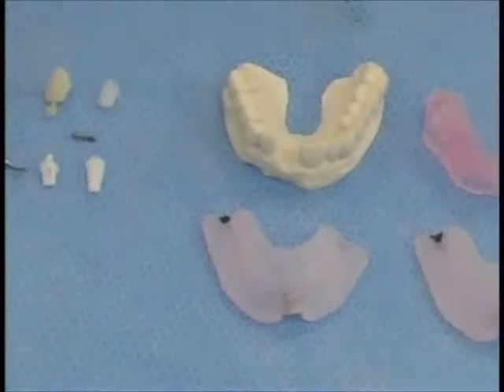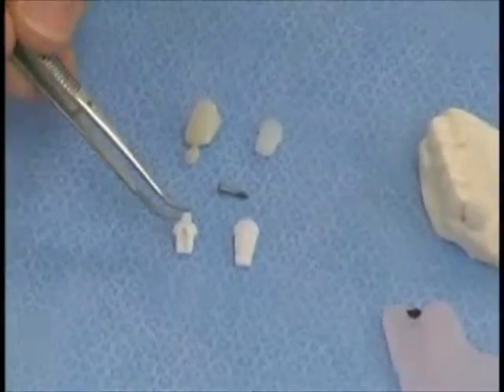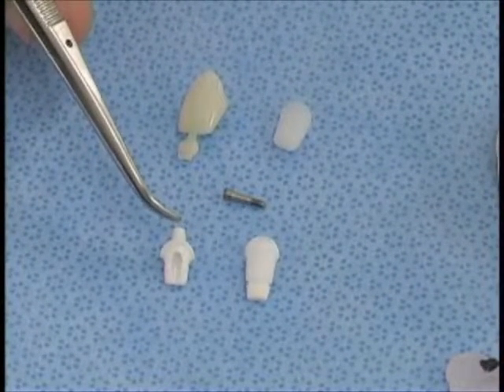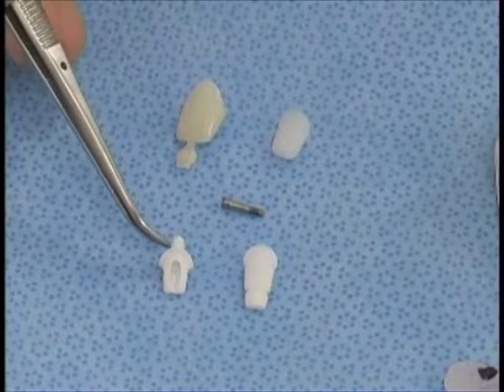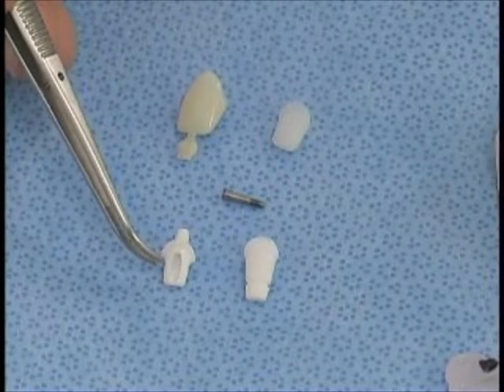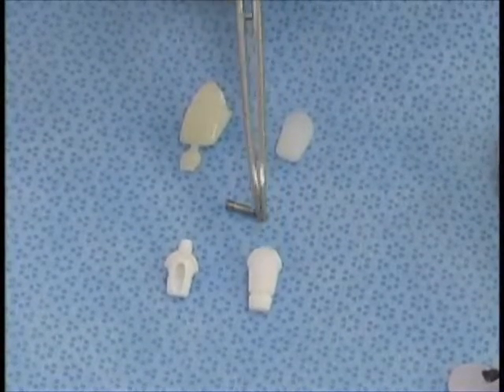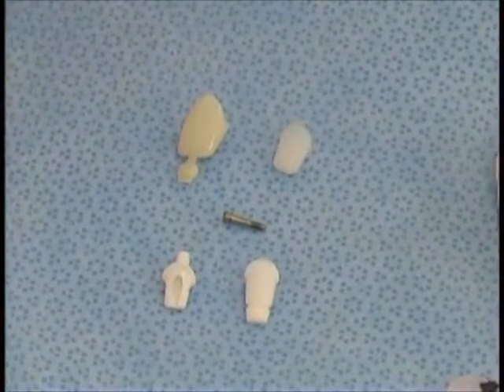On this side over here, you're looking at the restorative components. We actually will be utilizing restorative components that are, in this case, zirconium. This is a 4.5 millimeter diameter at the base for a Xive 4.5 millimeter diameter implant, angulated, 15-degree angulation. And next to it is a zirconium coping with a retentive component on the occlusal aspect of it.